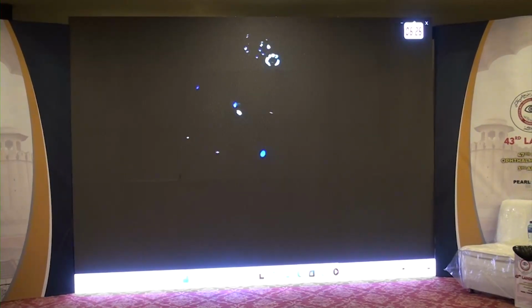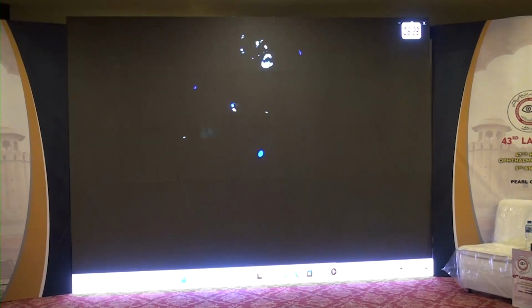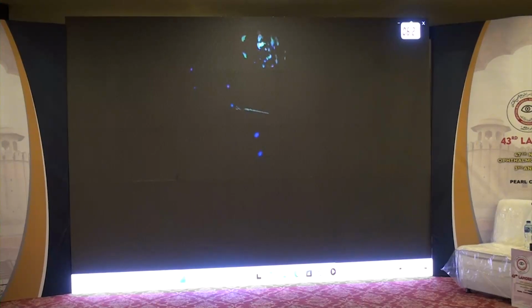For the epiretinal membrane, we will normally start with a vitrectomy. Then we inject intravitreal triamcinolone.